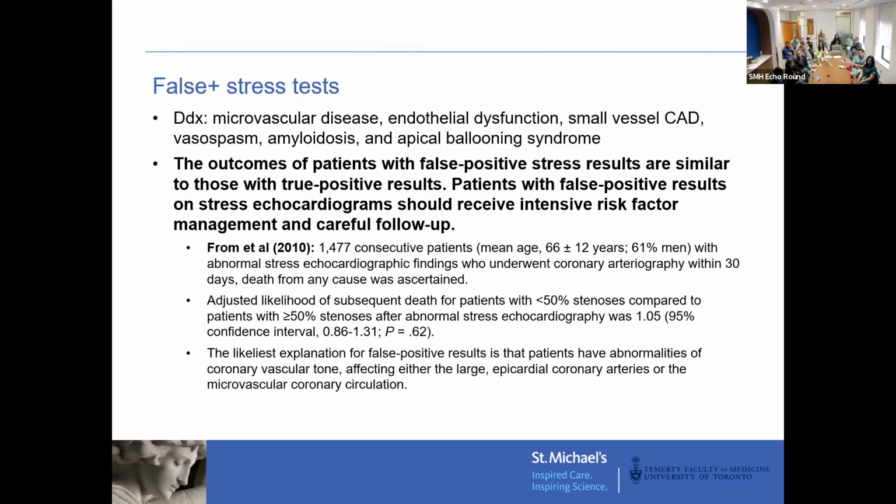Some other important points as well I wanted to make about false positive stress tests. So this is in patients who have a positive stress echo but a negative angiogram. The outcomes of these patients who have a false positive stress test were found to be quite similar to truly positive patients. And that's also a bit of an alarming finding.